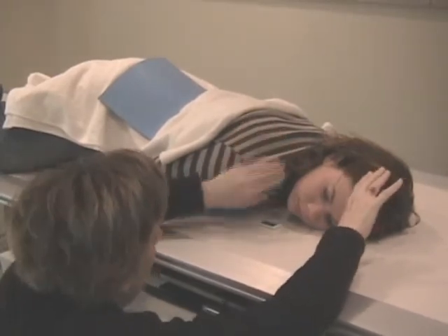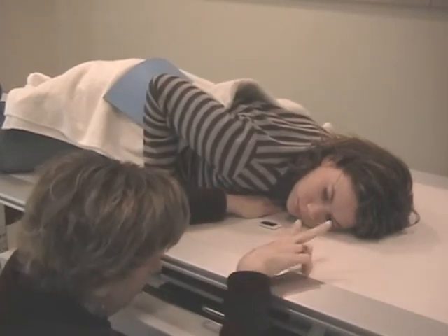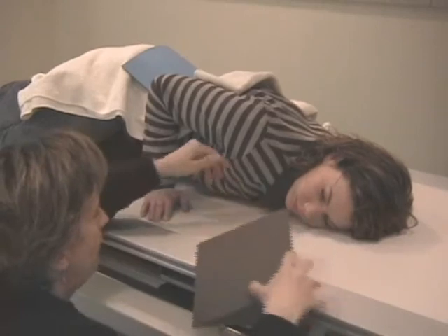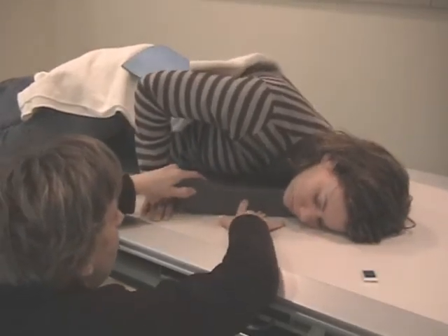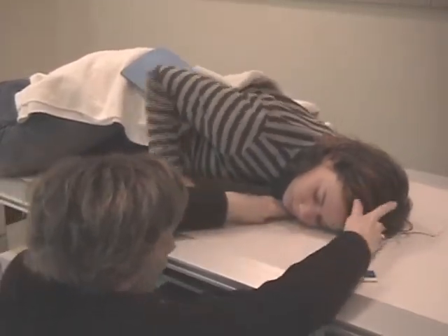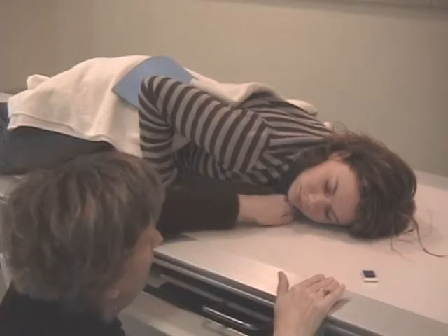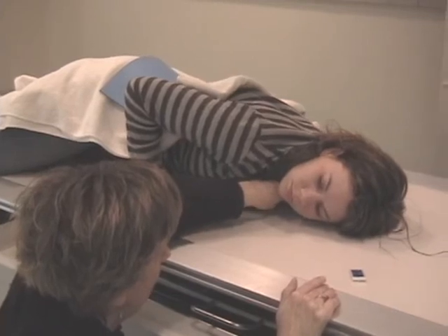There's a better way. If you come in under her chest here, see the chin is angling down. If we elevate her neck, see what it does to the chin there? And perhaps I might need to put a sponge, again, depending on the patient's chest size, underneath there to help elevate that. Then the chin doesn't have such a big drop, and I can just have her look up at me, and I don't have to reef on the skull as much. Again, it's so much easier if you come into the neck region. See how it elevates that chin.